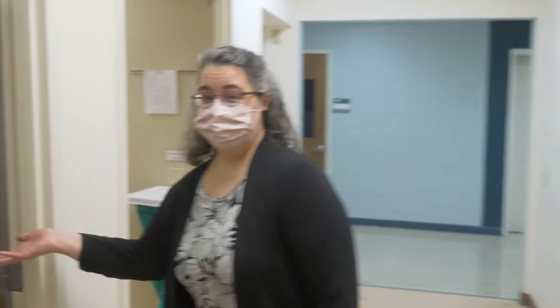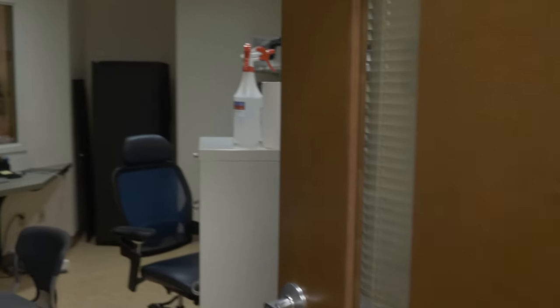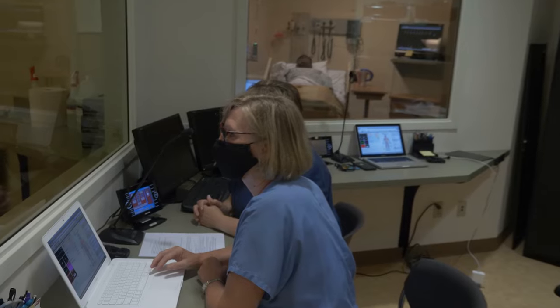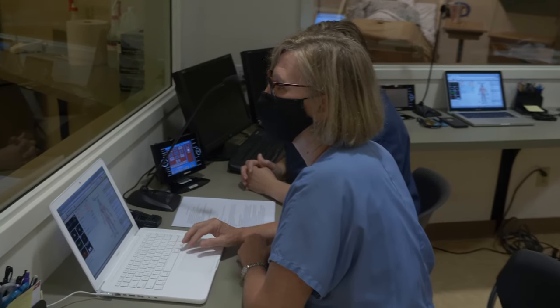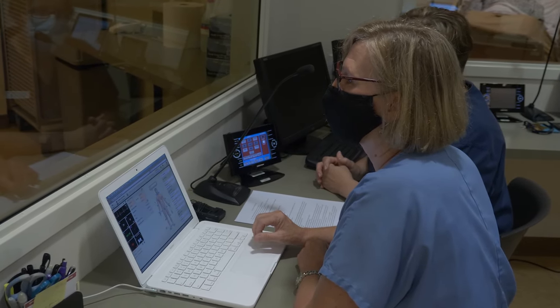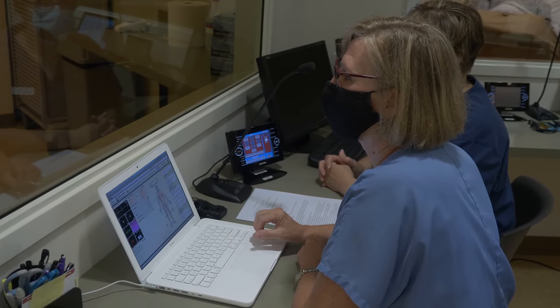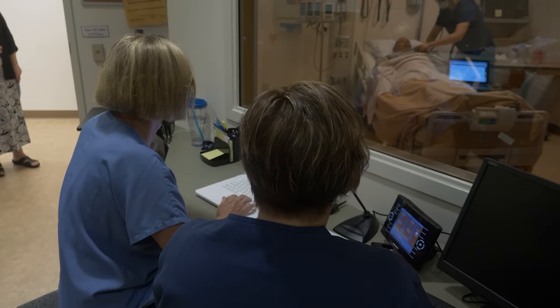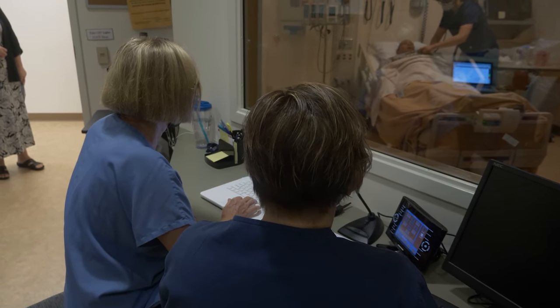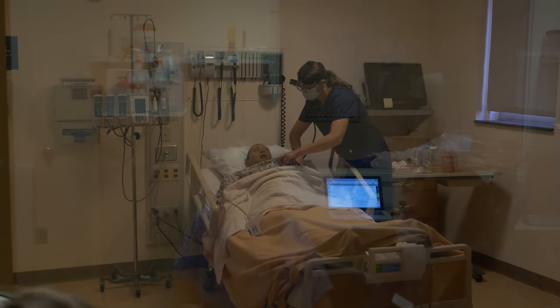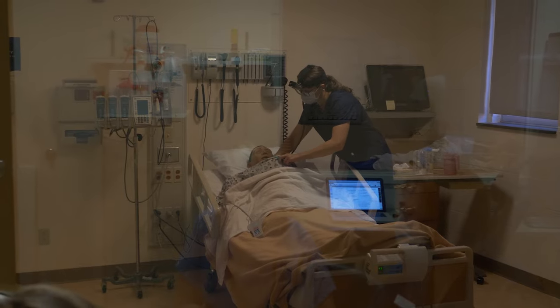Here's our control room. In this area, faculty monitor the student's progress and control the simulators. For example, if a student gives a medication that might affect blood pressure, the faculty can program the mannequin so that the blood pressure changes when the student gives that medication.